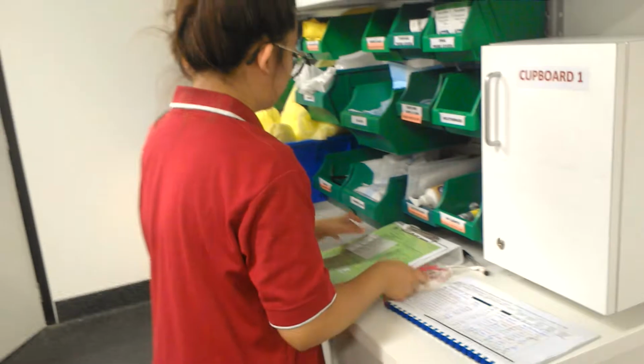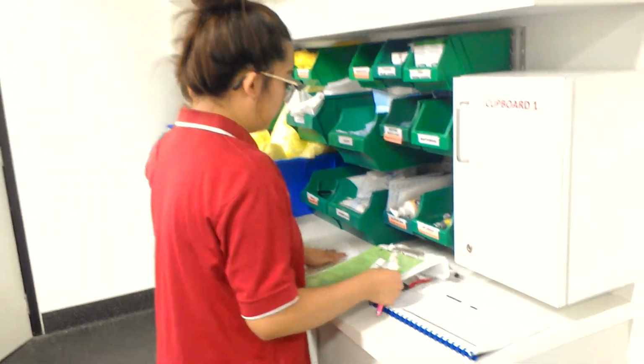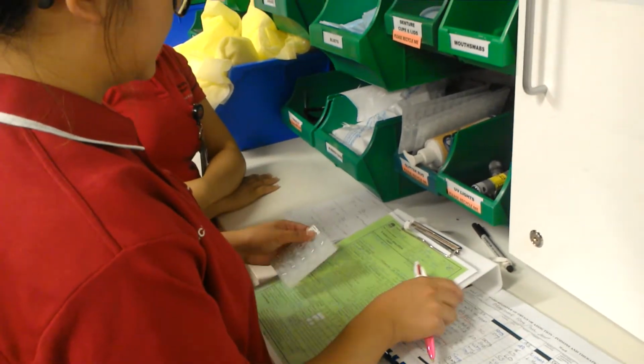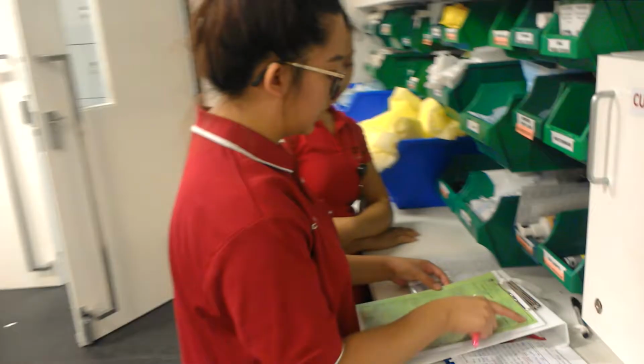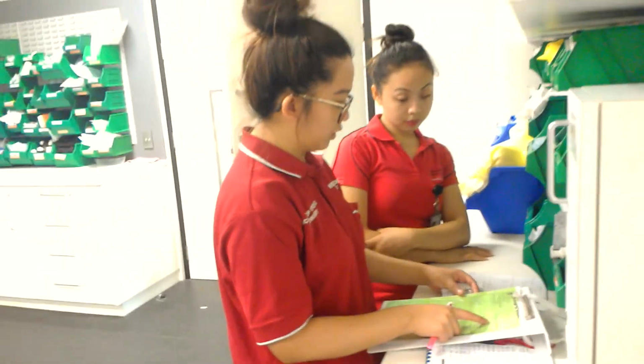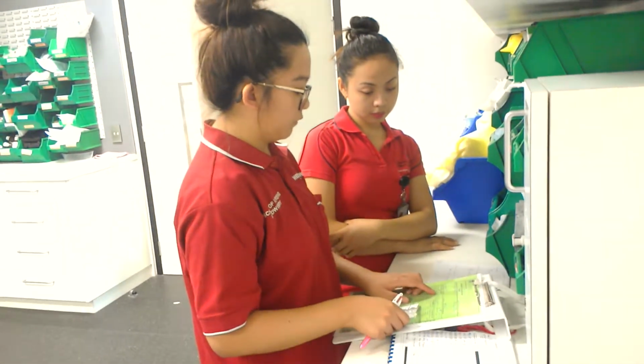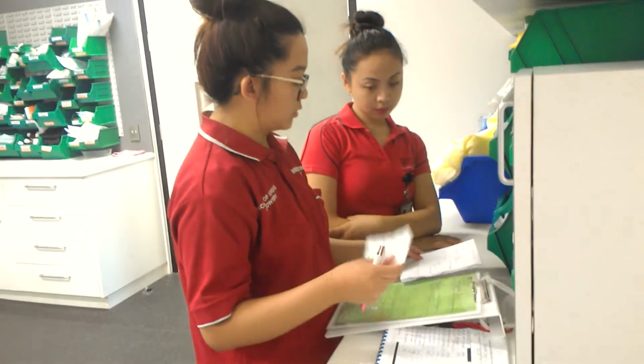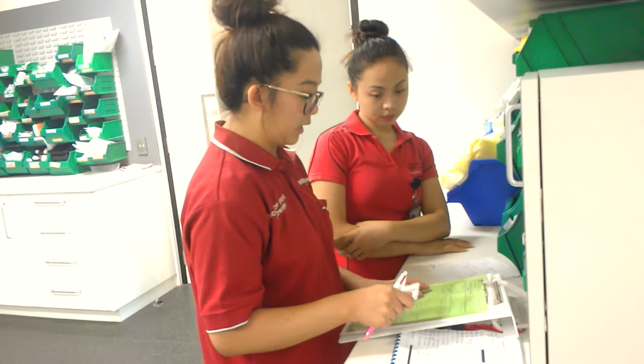I'll just do my first drug check with you now. So my patient for today is Miriam Added, date of birth 7th of the 1st, 1969, MRN 174963. She's got nil known allergies, and I checked this with the patient when I did the patient check with her. The order is for morphine, 50 milligrams in 50 mils, and based on my calculations, I needed to get 5 vials of morphine to make it up.